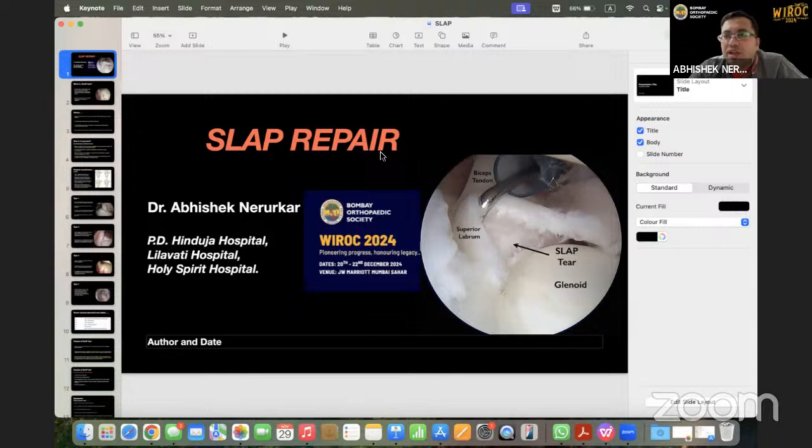And even though in all suture anchors the pilot holes are small, still inside the bone you have a big lump formation. That is the way it stops pull out. And that is why putting in too many anchors again is a problem, because you can't see what is going on inside. You can only see the face. And that is where the problem starts.